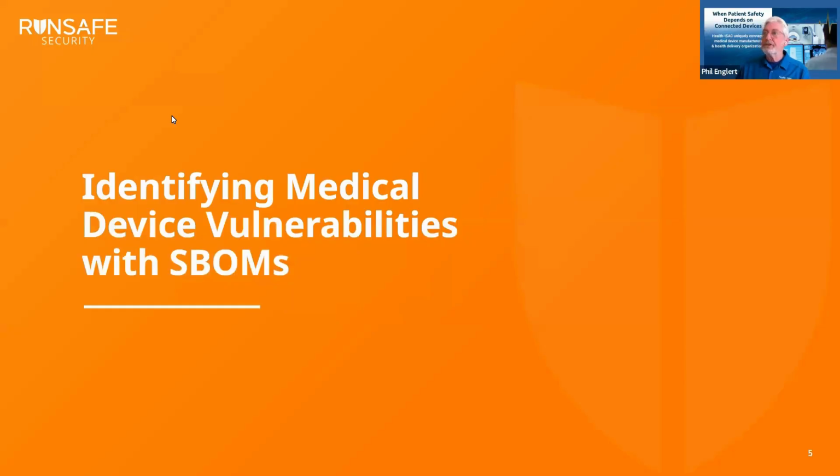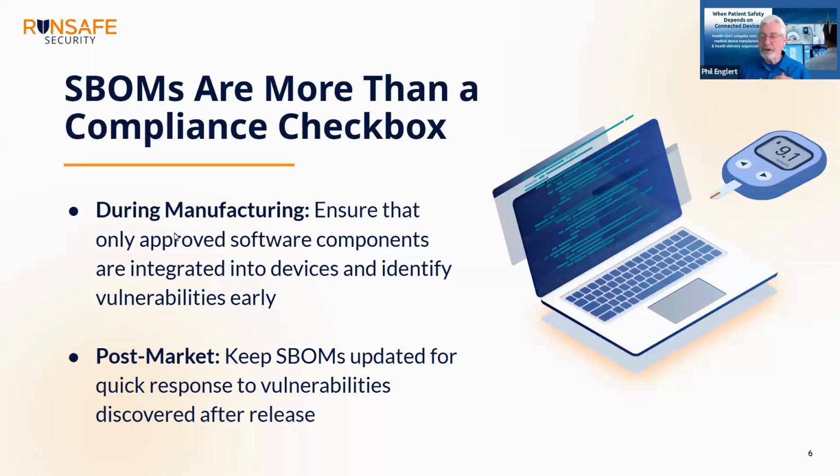Because we're talking about how important SBOMs are, and certainly SBOMs are asset management tools. They're lists of components, but they enable, and you implied this, that vulnerability management. So can you dig into that, unpeel that onion a little bit more, and talk about making the link between the components and the vulnerability management piece, both during production and post production.